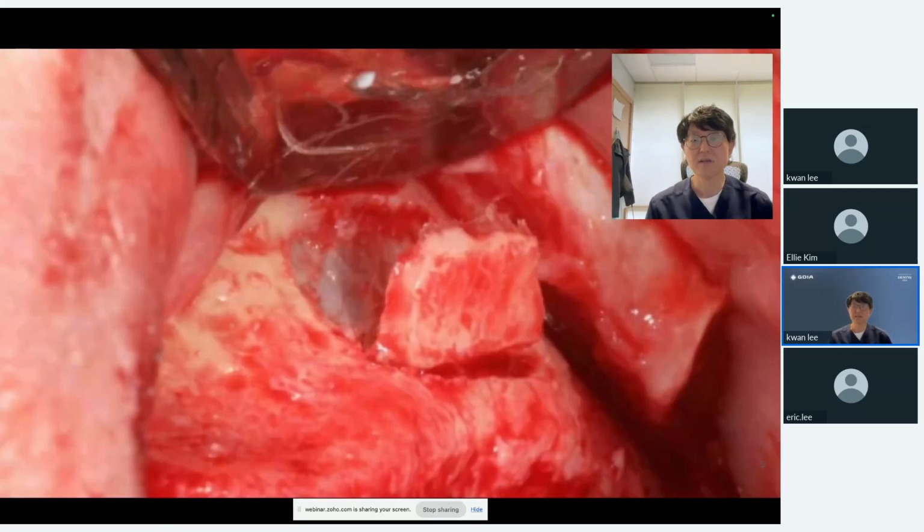So these are my photos of my lateral sinus. If someone asks me which method or approach I prefer, I usually say, without hesitation, lateral sinus augmentation, because you can see the lateral sinus wall, and once you see it, you have a sense of control.